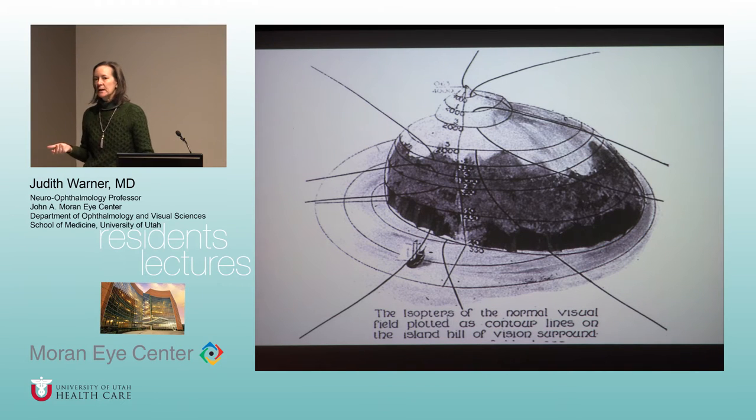So just to review, I'm going to hit some of the highlights of how to do visual fields, how to document visual fields, and then the anatomy of visual fields. Well, that's going to be very brief because most of that's going to be covered in the cases.